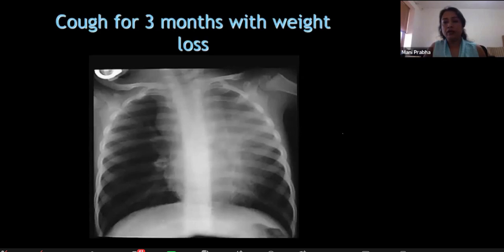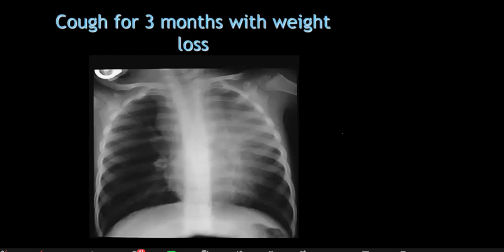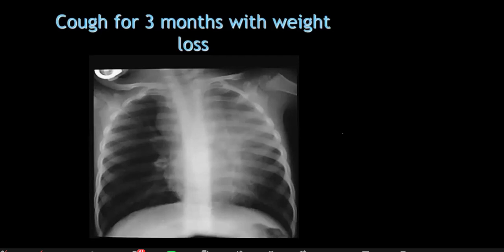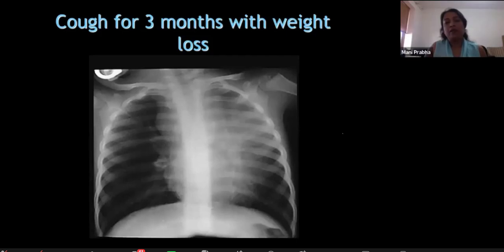Please raise your hand. Mani, let's go to candidate 7. Maybe there is something wrong. Okay. Oh, candidate 6 is there. Okay, I will unmute candidate 6 now. Candidate 6, can you hear us? Hi. Hello. Would you like to start describing?